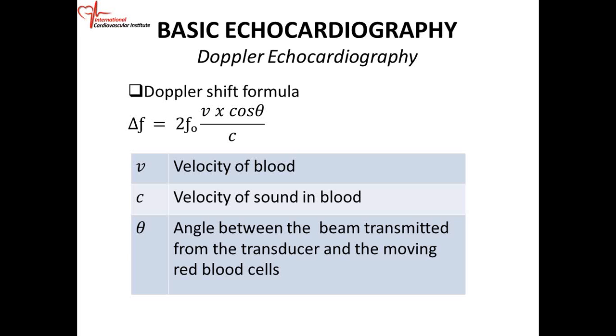It's not that it's not there, it's just that your angle is not adequate. You have to get that angle as parallel as possible to blood flow.